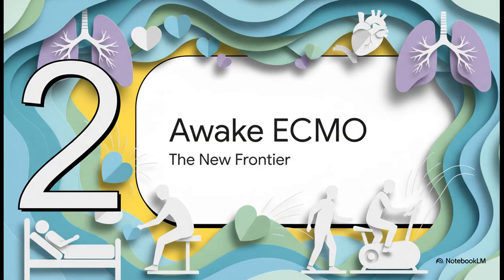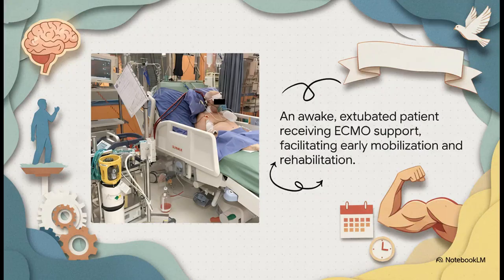Okay, now let's explore something that is a true game changer in ECMO care. We're talking about moving away from just passively supporting a patient to actively engaging them in their own rehabilitation by keeping them awake. And just look at this image. This is not the patient we traditionally picture on ECMO: deeply sedated, paralyzed, completely passive. This is someone who is conscious, breathing on their own, and actively participating in the recovery. The entire goal of Awake ECMO is to sidestep those devastating complications of prolonged sedation, things like ICU delirium and profound muscle weakness, and to get these patients up and moving as early as possible.